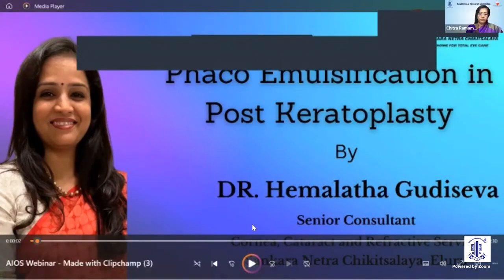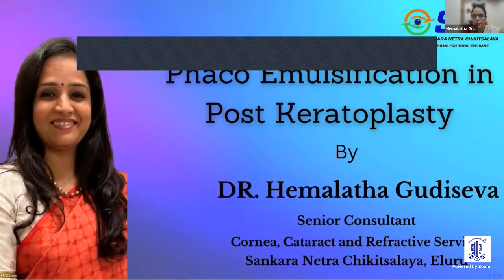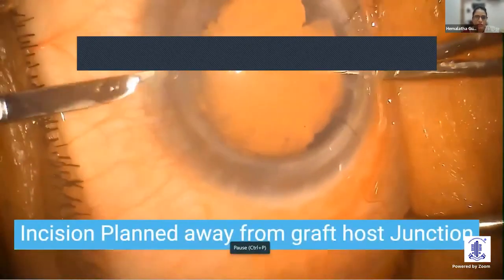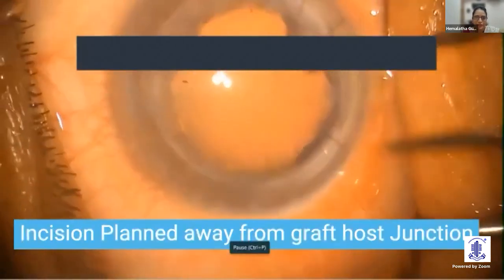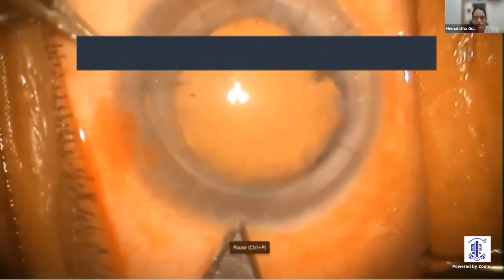So, this is a case of phacoemulsification in a patient with post-keratoplasty. So, this patient is actually a one-eyed patient.